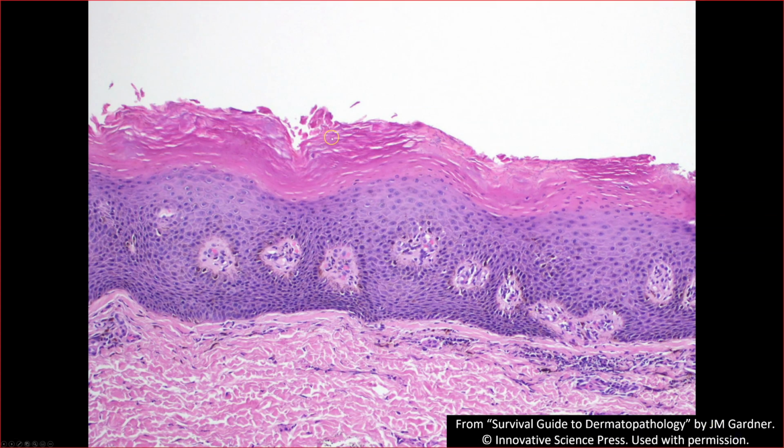So again, the compact ortho, sometimes there's a bit of spongiosis, sometimes there's pigment dropout and a little inflammation, but oftentimes, just like that case, the virtual slide, totally devoid of inflammation. And here, you can see it better. See the little blue wispy guys here?